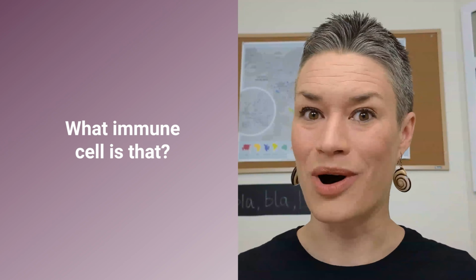What do I mean by quantifying? What questions are we going to ask ourselves in image analysis of immune cells? Very simple. Question number 1, what immune cell is that? And question number 2, where is it? We're talking about immuno-oncology, so by definition, we're going to be quantifying those cells in the tumor and around it. So the question, what immune cell, is going to be answered by the immunohistochemistry marker that we're using. And the question where, there are a couple of options. We can just quantify them in the tumor in general, and I'm going to show you an example in a minute. We might need to be more granular.